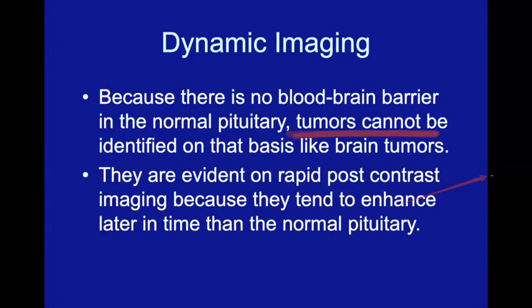Dynamic imaging, I think, is helpful. It appears that someone is marking on the screen. I would ask that you turn off whatever you're annotating here.